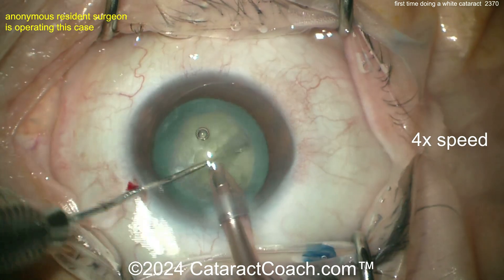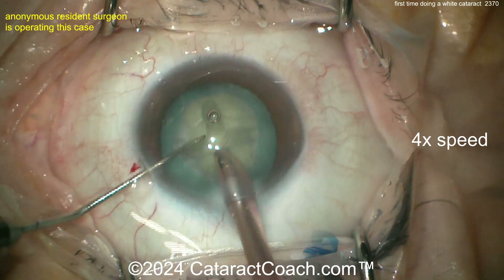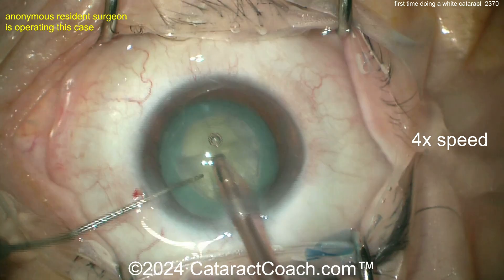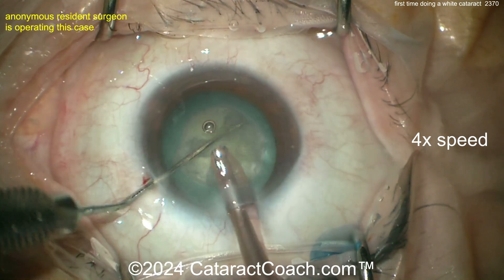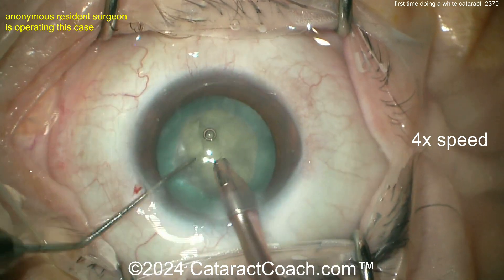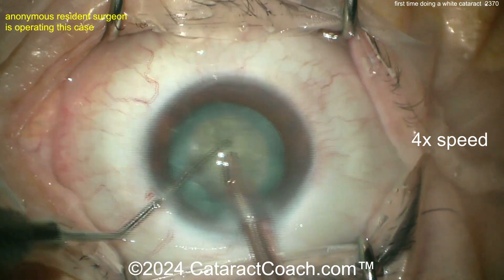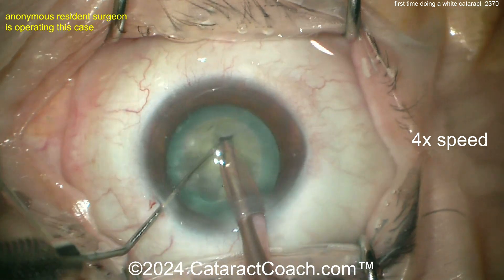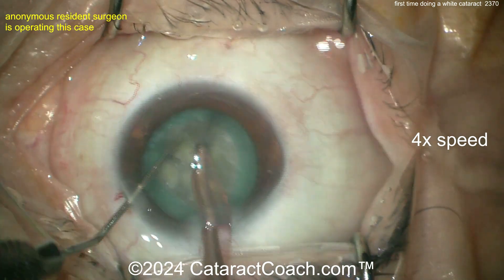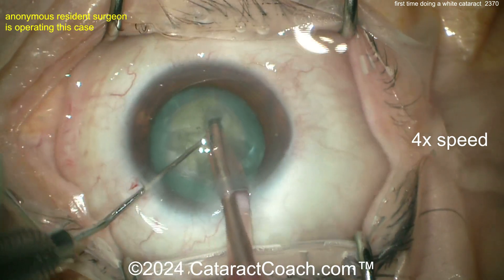Grooving down the middle — looks like a stop-and-chop or divide-and-conquer technique. Good job using your hands to keep the eye in primary. Good rotation of the nucleus. Now split it — a little bit more — yes, there's a good propagated crack all the way through. Do it again, propagate that crack one more time, then keep rotating. You want these four quadrants fully separated — if they're still attached and you try to bring up one quadrant, it gets stuck.